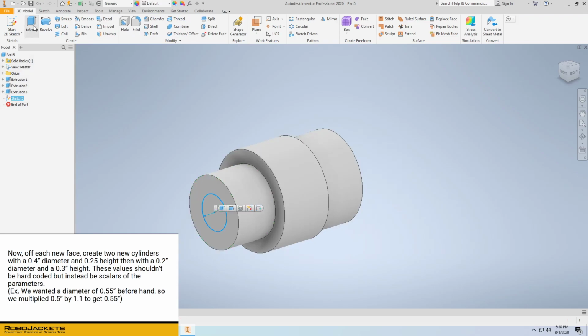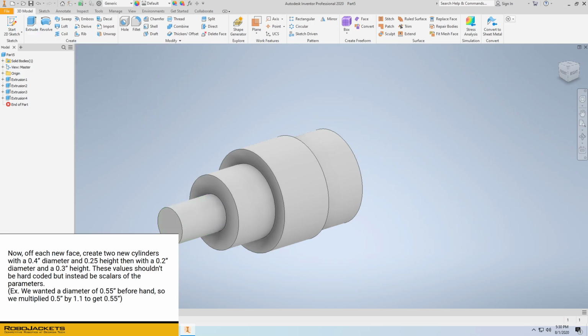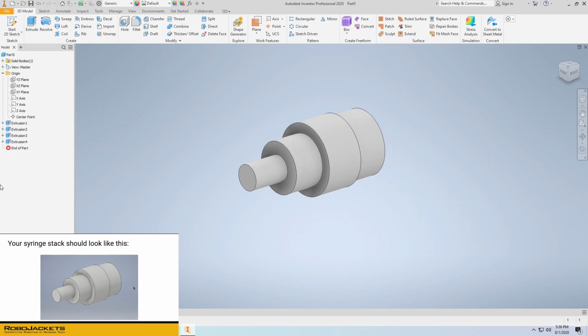We'll extrude this sketch just as we did before. The thickness should be 0.3. Main thick is 0.25 right now, so we need a 20% increase, which means this value should be main thick times 1.2. This means that with our 0.25 height of main thick, scaling it up by 1.2 should give us the correct thickness. There we go. And here we are. At this point, your syringe stack should look like this.